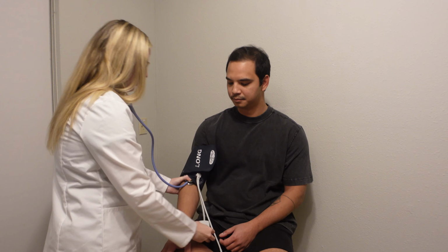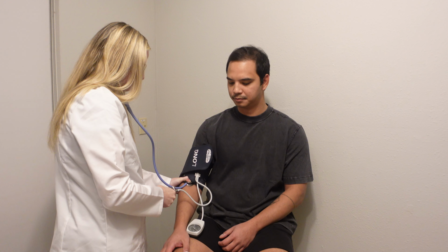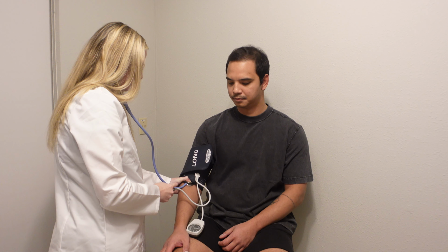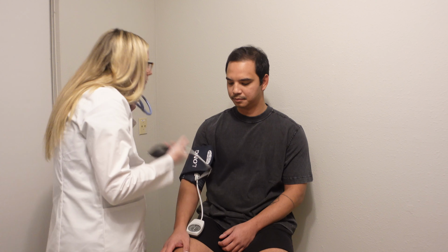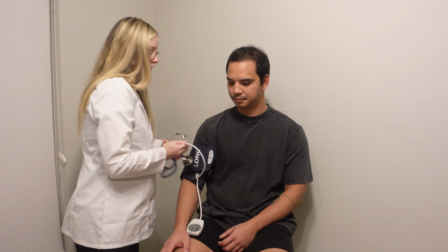And this is going to get tight. Blood pressure was 123/78.